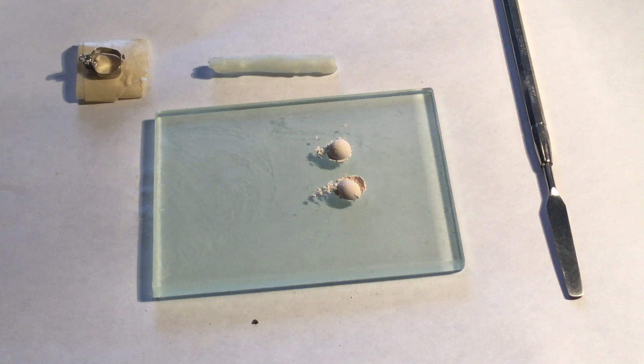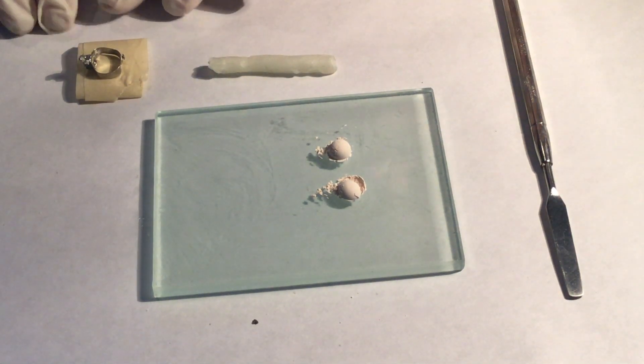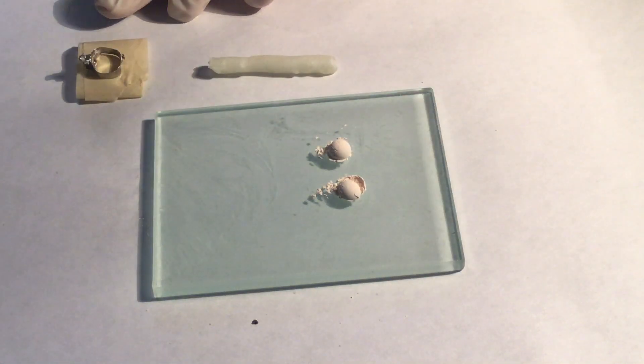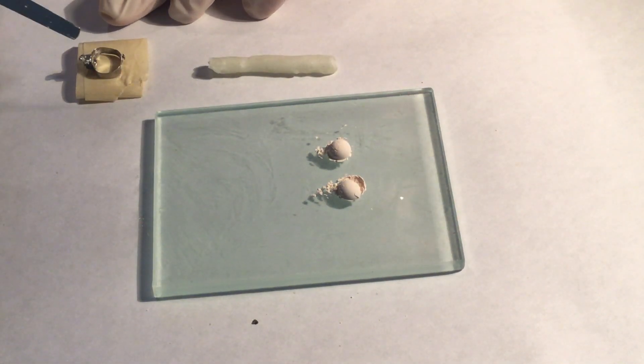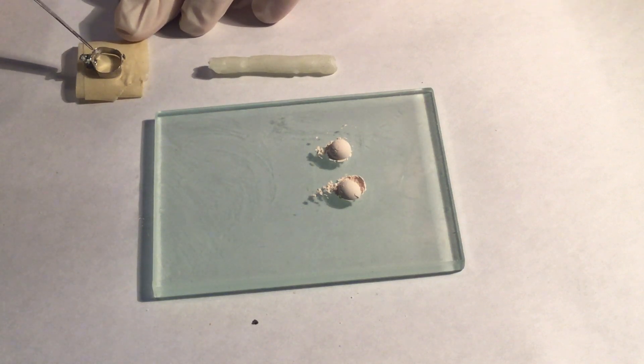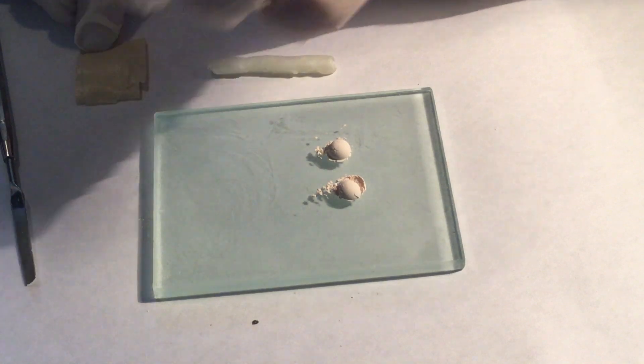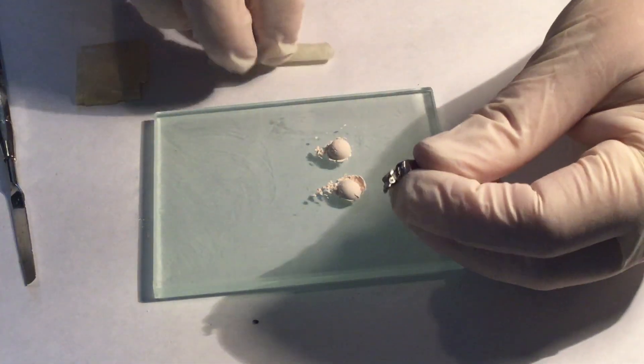Mixing Cement for Orthodontic Bands. Step number one is to make sure that the band is clean. Place ortho wax on the buccal tubes.